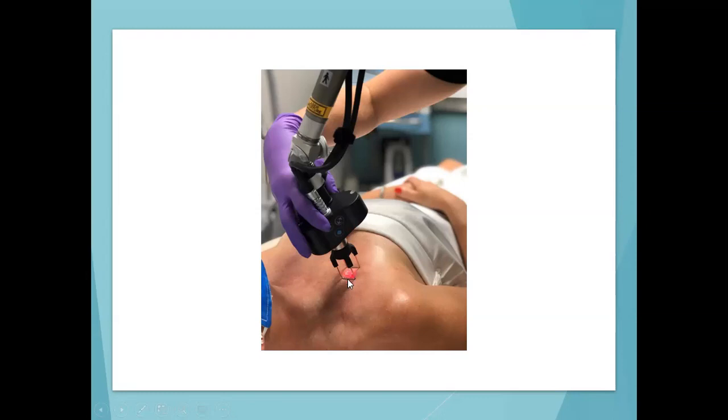So the dots are not uniform here because if you were watching it live, it sprinkles, it kind of does this little scatter of the dots in that little square area. So each pulse does this little spray scattering of little dots of damage. But I love this picture because it captured the little dots visually. So you can see the laser is actually drilling. I'm going to use the term drilling. It's not like a physical drilling, obviously, but it's literally creating a little channel of damage with that energy everywhere you see one of those dots.